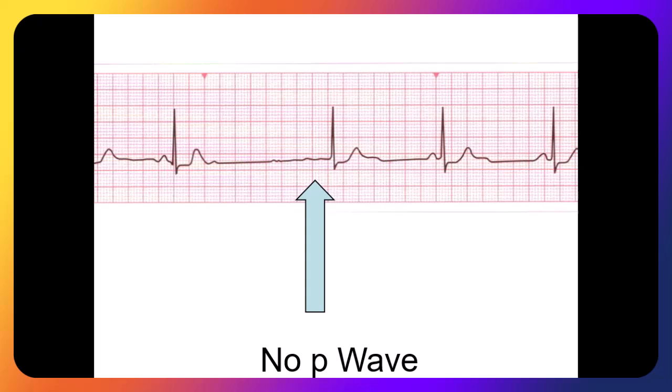Anybody see a P wave there? Yeah, you got a little bitty bump here, and you got a bump there. That's probably either hair or the patient's moving. That would simply be artifact. So I would tell you we do not have a P wave prior to the impulse.